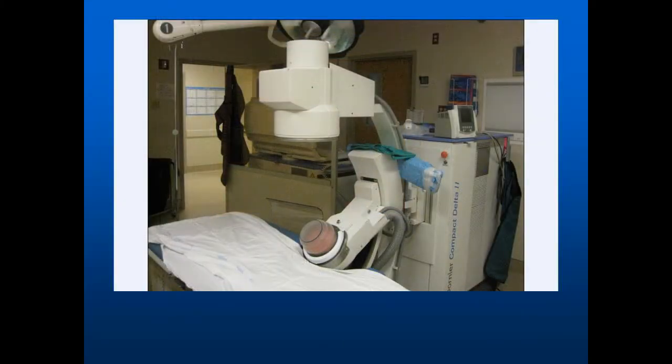So we can apply shockwave, focus it on our kidney, and break the stone without ever physically touching it with anything I've shown you up to now, except the radiograph that tells us where the stone is and shows us how to focus the system so we're actually treating the stone. This is the area that receives the energy that this area is focusing on, and this is a radiograph that keeps us on target. So we can adjust energy and we can focus energy on the stone.